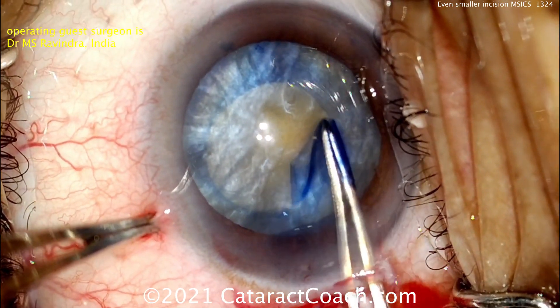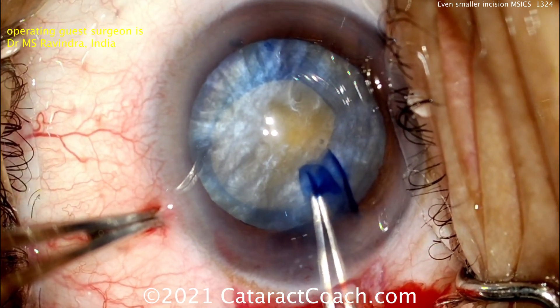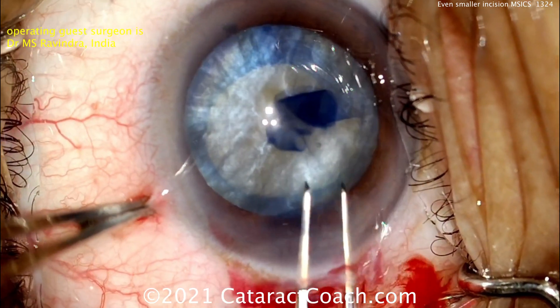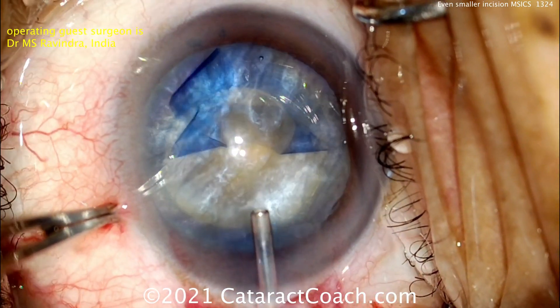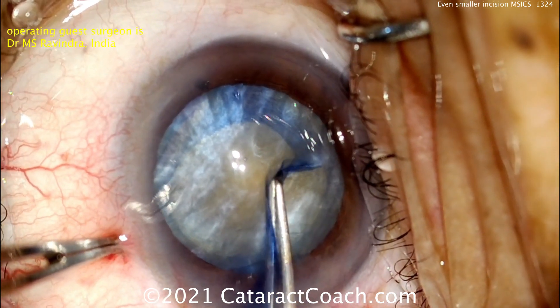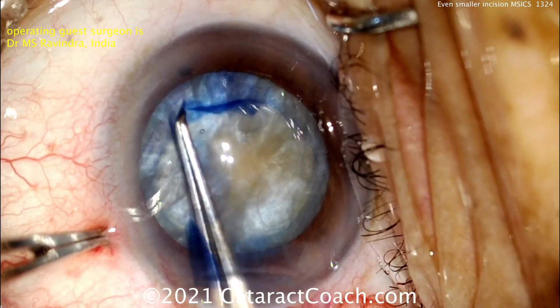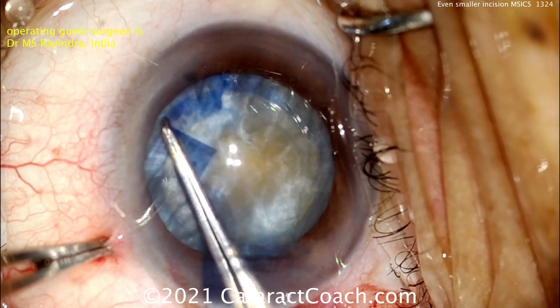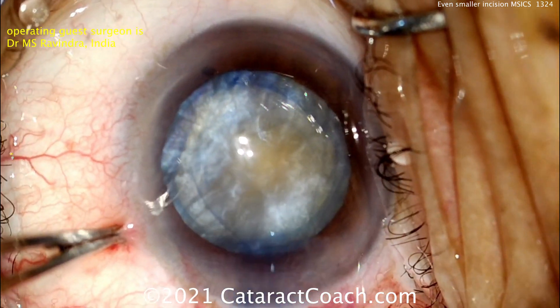Now look at the trick here of getting a big rhexis. Do not make a baby rhexis. We want to get this nucleus up out of the capsular bag. If your rhexis is smaller than five millimeters, that's going to be quite a challenge, especially when it has this high level of density. So you want to get this nucleus up — let's make it at least a five and a half millimeter rhexis. This looks just about perfect right there.